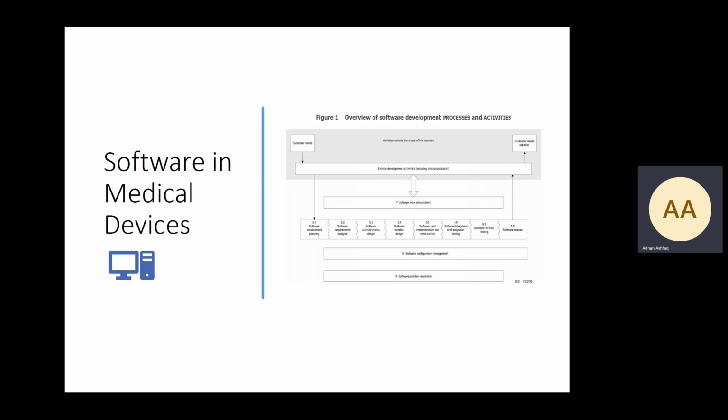But the second thing it also does is it classifies the medical device as a whole, assuming at this point that the device or product is actually a medical device, because we've now gone past the medical device's definition. We are now looking at the classification of software and then classification of the medical device. In the US, there's three classifications, in Europe, there's four classifications, 1, 2A, 2B, and Class 3.